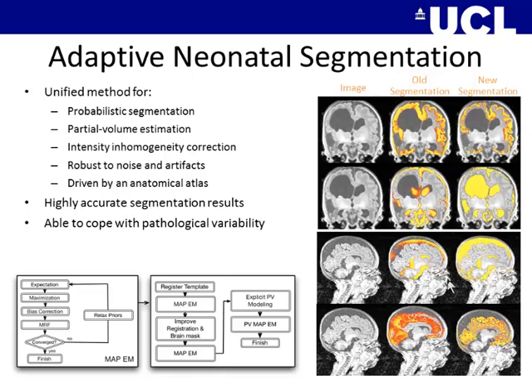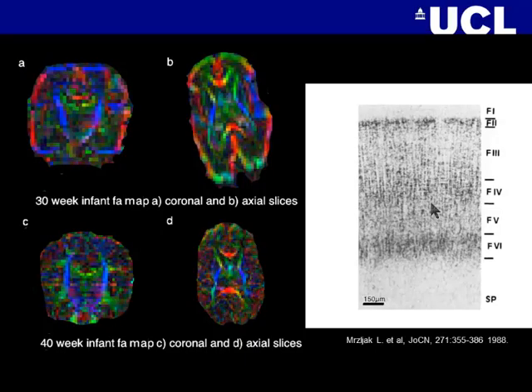For example, in this case, as you can see, the standard type of tool will actually completely miss some of these areas. And then moving on a little bit into more detailed assessment of the white matter.